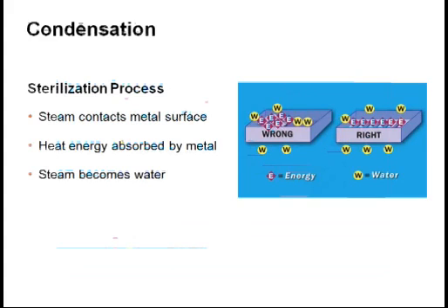This picture represents the condensation process with steam contacting the surfaces of the instruments. During the sterilization process, steam becomes water or condensation when coming in contact with a cooler surface. There is likely to be more water remaining in the tray on the left since these instruments are piled on top of one another, overwhelming the area with condensate that could be difficult to dry.